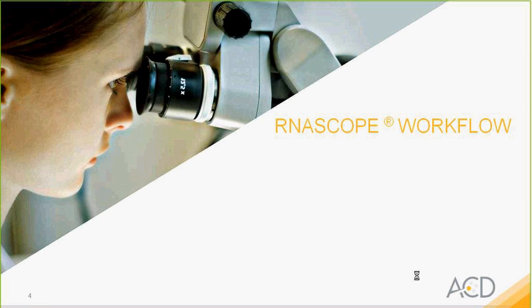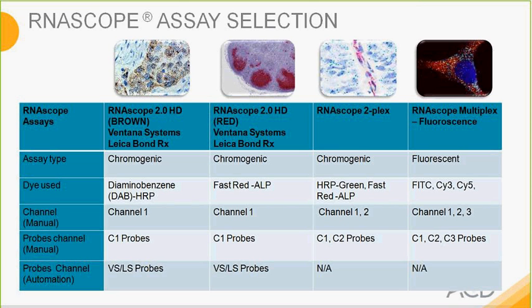To discuss in detail the RNAscope workflow, we'll first review the products that we have available. Some of you already have purchased these products, some of you intend to purchase these products, or some of you are waiting to use these products. We have 4 basic products in our RNAscope platform.